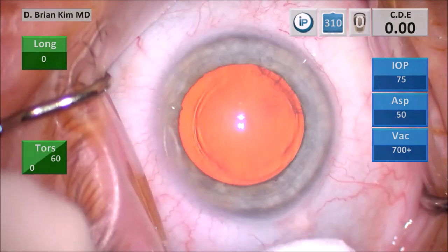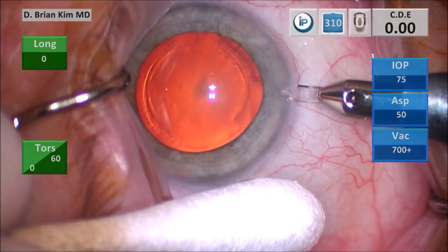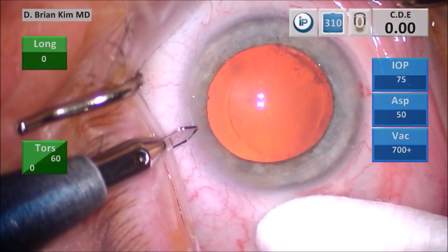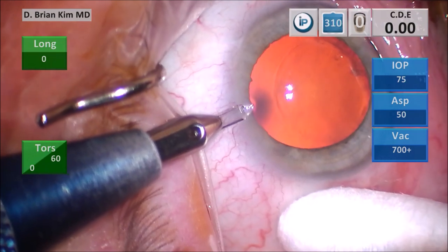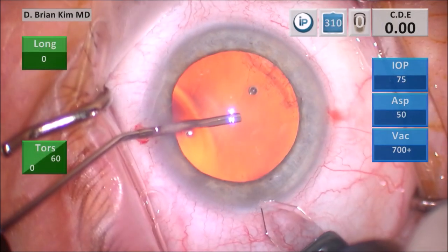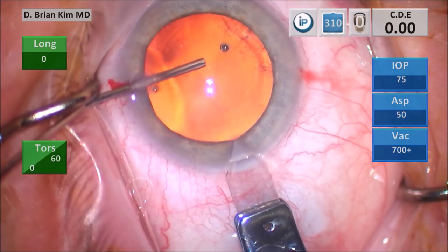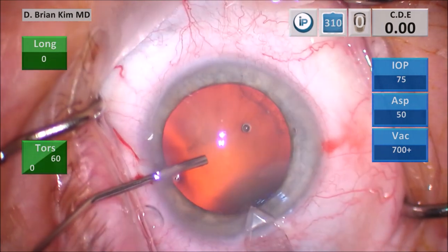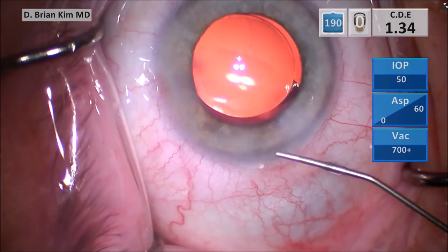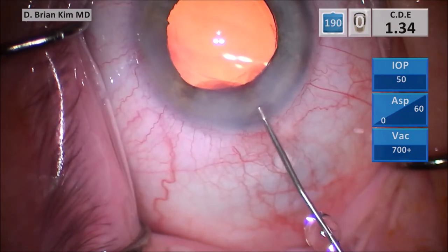Here's another case. Mark the central cornea and use a cotton tip to pull the eye to the left — flatten out your hand so that you can approach the paracentesis flat to the iris. Make a nice rectangular incision. Do the same thing on the left side using the cotton tip to pull the eye to the right, with a flat approach parallel to the iris plane. Use a cannula to fill the eye with viscoelastic, make a vertical groove through the limbus, tunnel through the deepest part of the groove, and go into the eye to create your triplanar main incision. After you're done, hydrate the sides of the wound with BSS, then turn the cannula upward and sweep side to side to hydrate the roof of the incision.